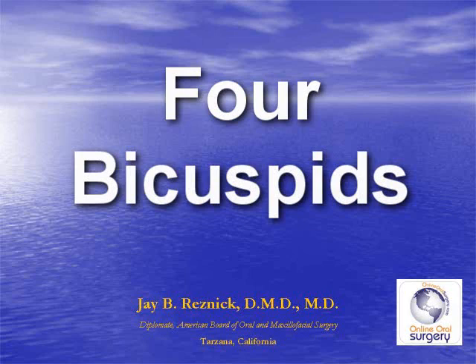The difficulty with this type of case is that these teeth are being extracted for orthodontic reasons, and one thing I've learned as an oral surgeon is that the one thing that orthodontists want more than anything else when they refer a patient for extraction of bicuspids is that you get the teeth out completely atraumatically with absolutely no loss of any bone. And in addition to that, you have to be sure that you get the tooth out in its entirety without leaving any root tips behind, because the orthodontist is not going to be able to close spaces if there is a retained root tip.